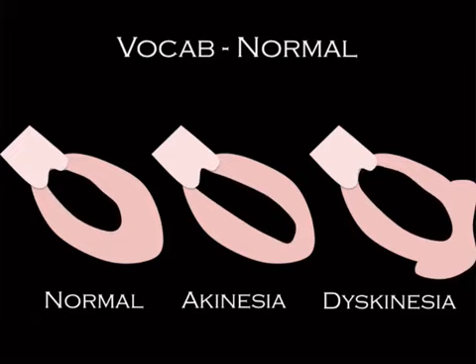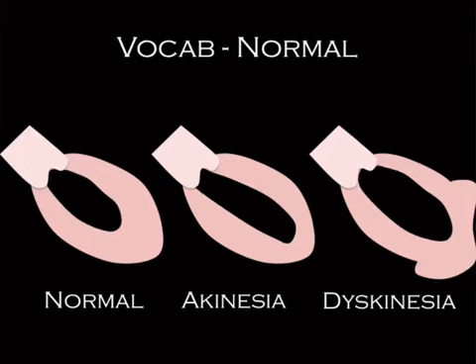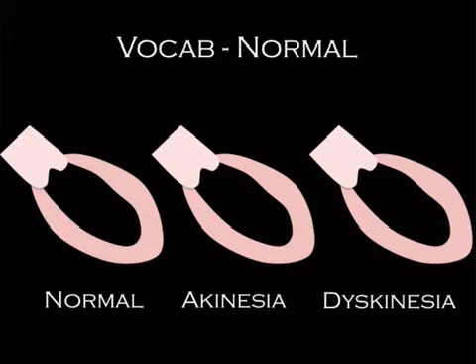That's normal. Now the word hypokinesia is used when it thickens all the way around, but not as much as it should be. I think this is really hard to show because it's kind of subjective. I don't think that they'll show that, and that's why I didn't even put it down here. But if they write it out in words, hypokinesia does contract, it just doesn't contract as much as it should. Now akinesia is a segment that does not contract at all.